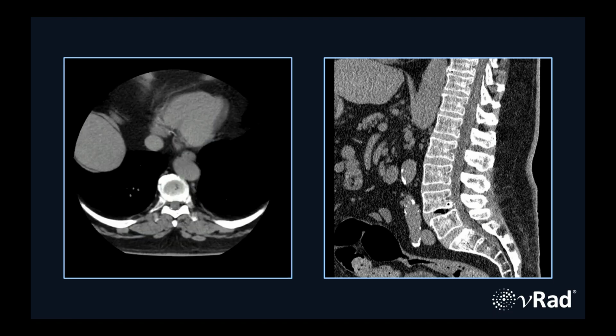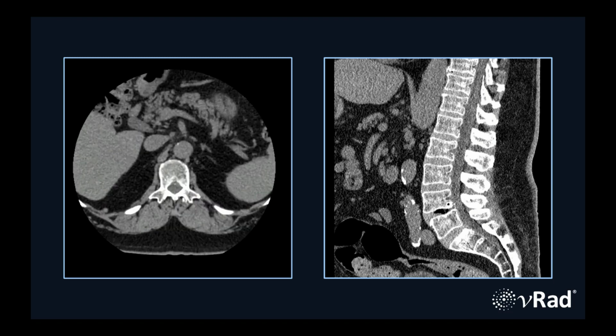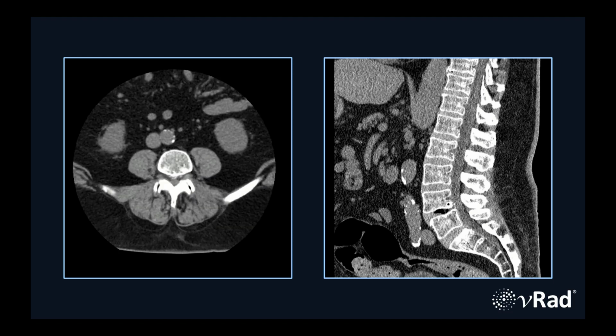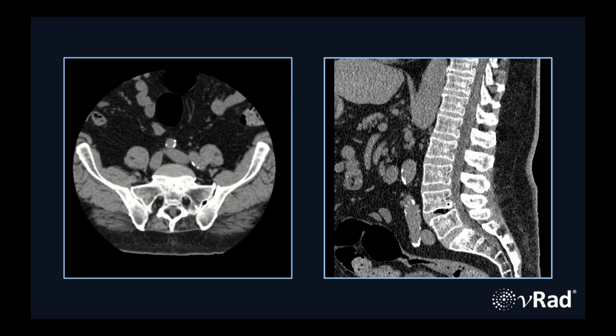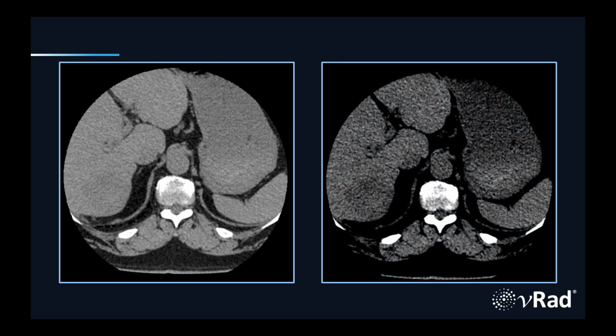But if we look outside the lumbar spine, we'll roll through the axial images again. That's where the great call was made. No, it's not the left renal cyst. The great call was made on this image, again, non-contrast. If we place it on liver windows and direct your attention to the right posterior liver, you'll see a hypoattenuating, ill-defined hepatic mass, which was certainly a great call, very clinically significant.